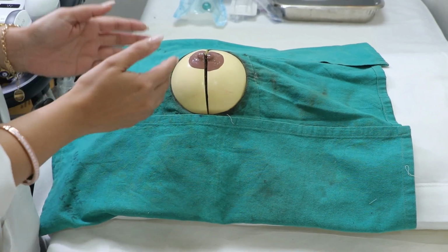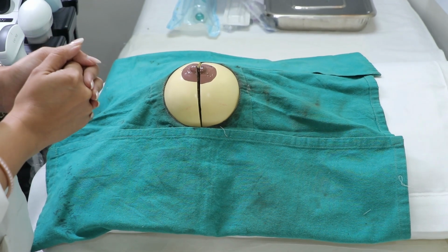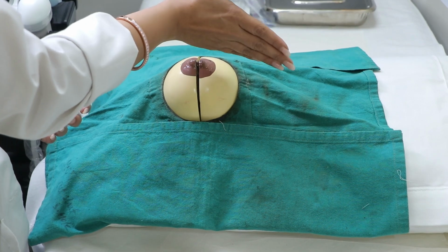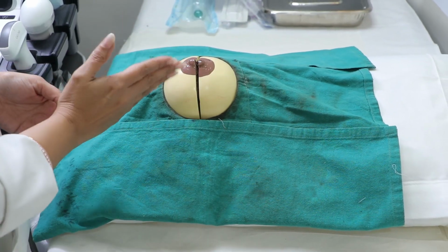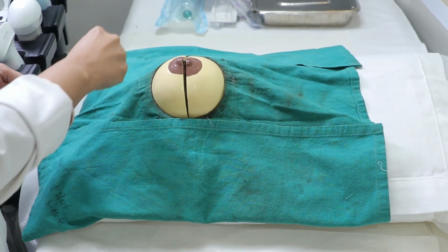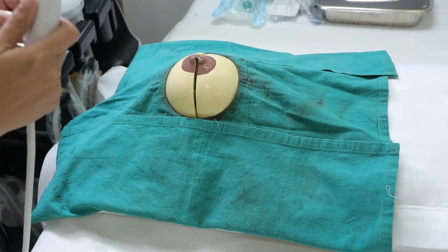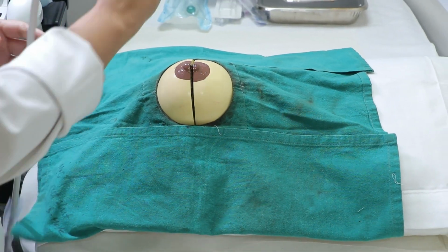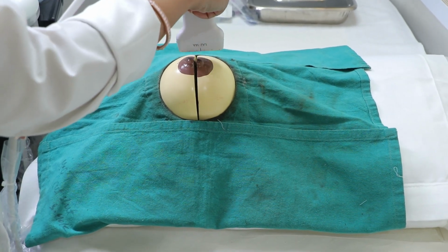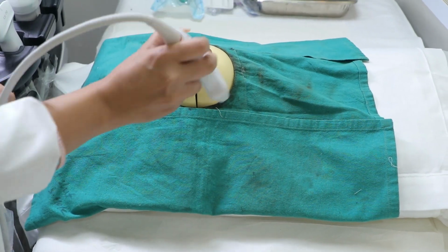ultrasound perspective. As I have told you before, for the breast we have to consider a clock position. This is 12 o'clock position. 1, 2, 3, 4, 5, 6 o'clock position, 7, 8, 9, 10, 11 and 12 o'clock position. So we are going clockwise. Similarly, we will use the ultrasound probe and we will go from the outer margin of the breast towards the nipple from 12 o'clock position and so on as a clock.